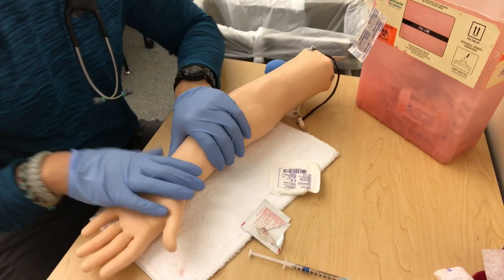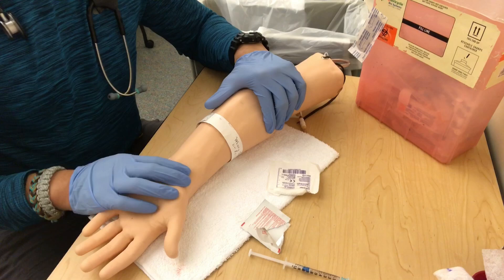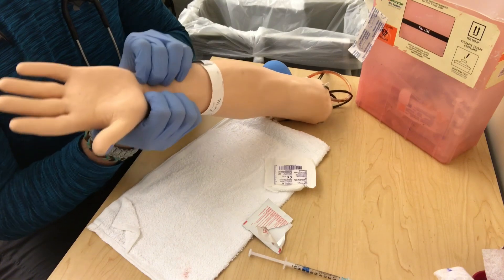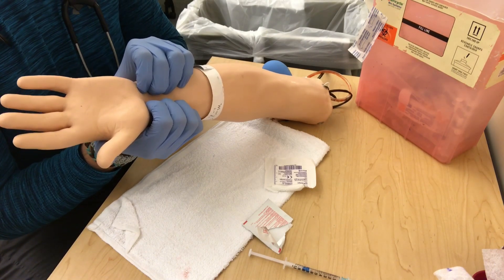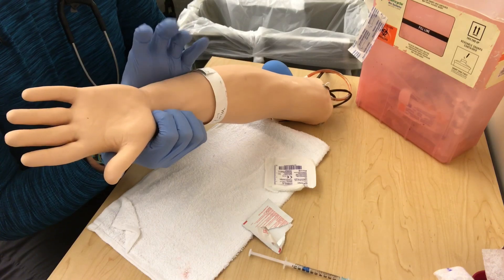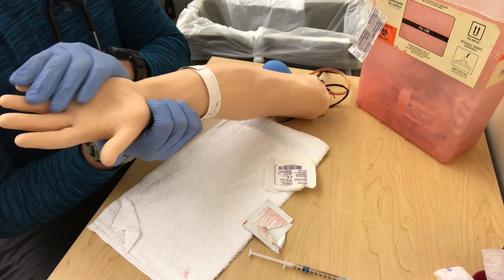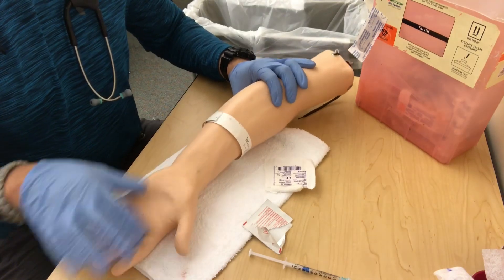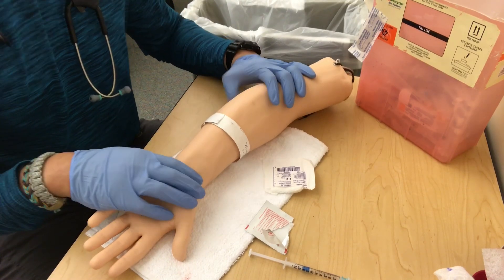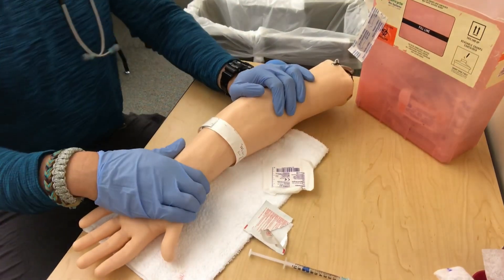We're basically checking for collateral blood flow from the ulnar to the radial artery. We take the arm, occlude both the radial and ulnar artery, and have the patient make a fist and hold it for 30 seconds. Then we release the ulnar — the hand should be white — and we're looking for blood flow returning within 10 seconds, which shows collateral blood flow. Current studies show the Allen's test has limited ability to predict rare ischemic complications — the evidence neither supports nor refutes it — but it's good to know.